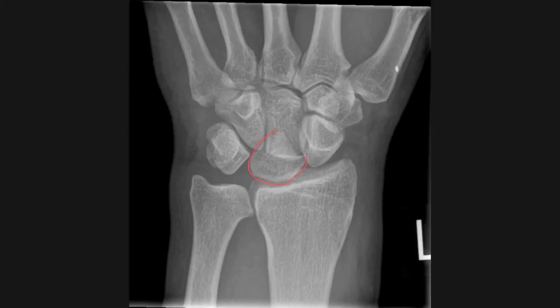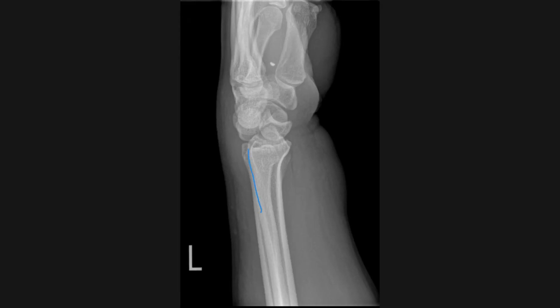Let's take a look at this example. On this PA view of the wrist we can see that the lunate has an abnormal triangular configuration. When we look at the lateral view we can see the distal radius lines up with the lunate, however the capitate is out of line, and this is in keeping with a perilunate dislocation.